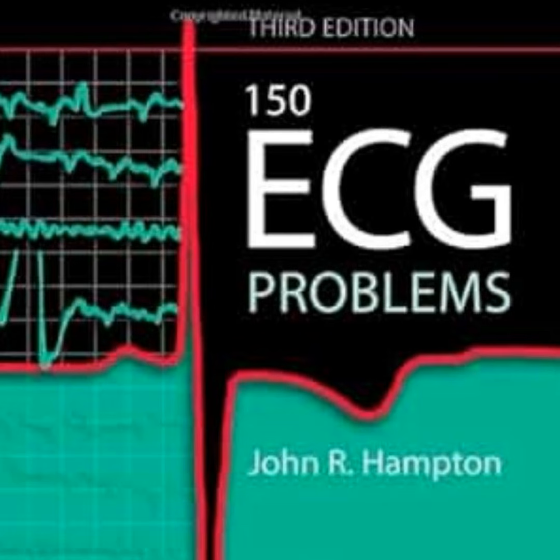Yes. If you alter the extracellular concentration of potassium, you alter the concentration gradient across that cell membrane. So in hyperkalemia, you have too much potassium outside the cell. That altered gradient causes a much faster, steeper repolarization, which is what narrows and peaks the T wave. Oh, wow. And then in hypokalemia, the repolarization is prolonged, which flattens the T wave and actually exposes the U wave.